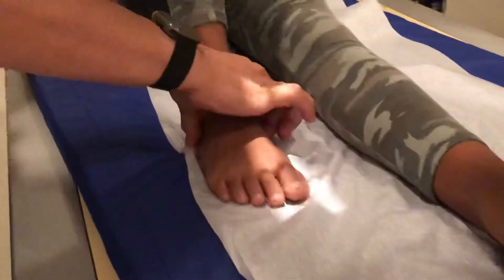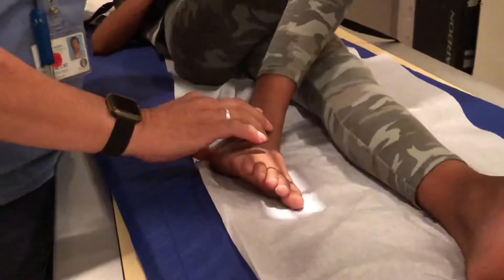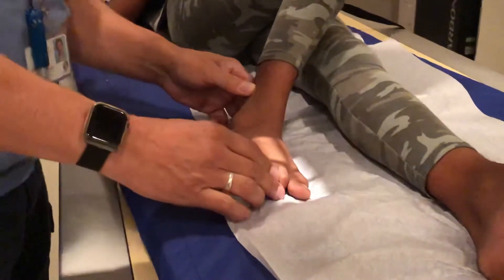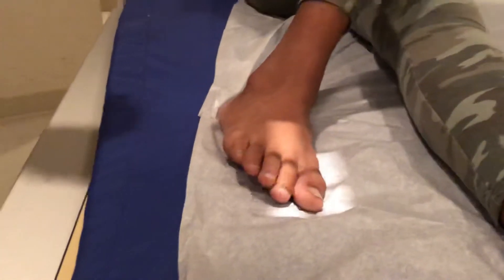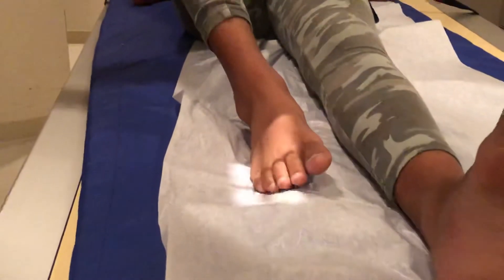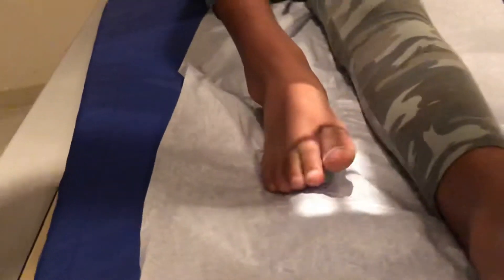The second one, you are going to internally rotate a little bit about 45 degrees, and if you can bend these toes back, center here again at the base of the toe. The third one is gonna be the opposite oblique, and that's gonna be at again about a 45 degree angle, and we'll shoot it like this.